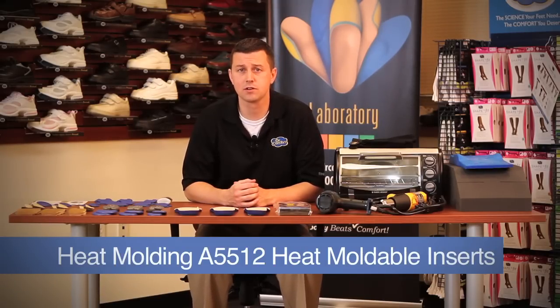Hi, I'm Brian Lane, Certified Pedorthist with Dr. Comfort. In this video we will be discussing and demonstrating how to properly heat mold A5512 heat moldable inserts.